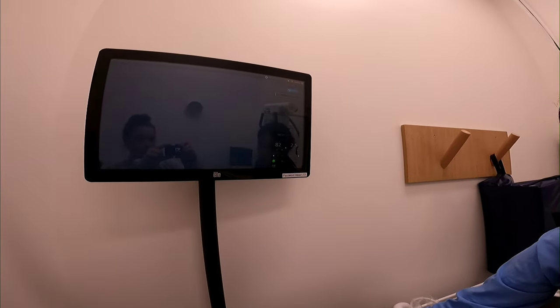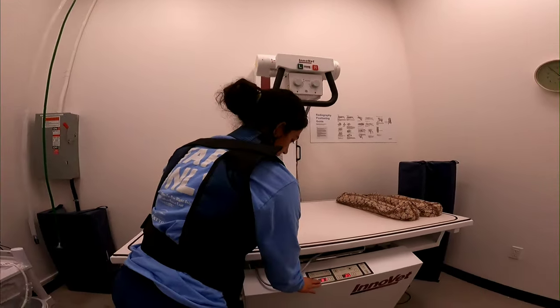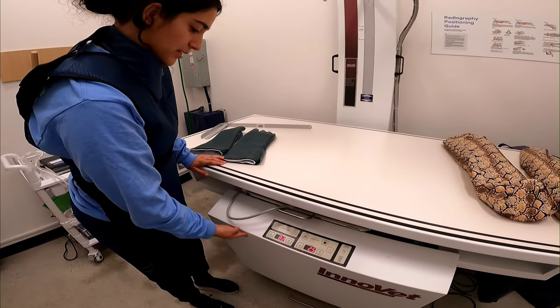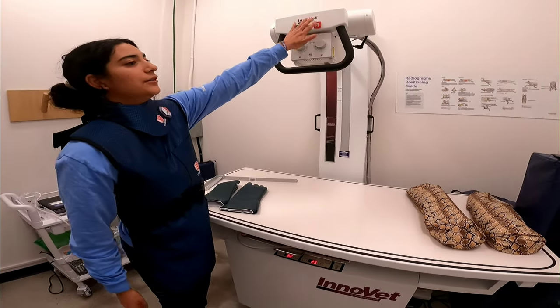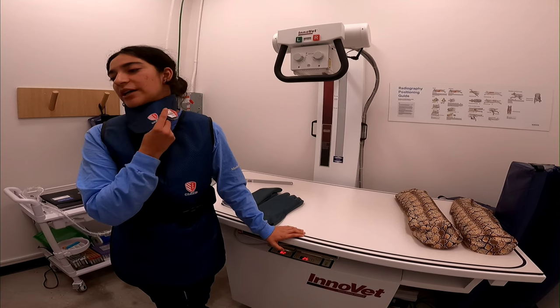We have 82 kVp, 2 and a half mAs. We're gonna set it on our machine: 82, 2 and a half mAs. Have our markers ready, and my lead gloves, and my dosimeter badge.